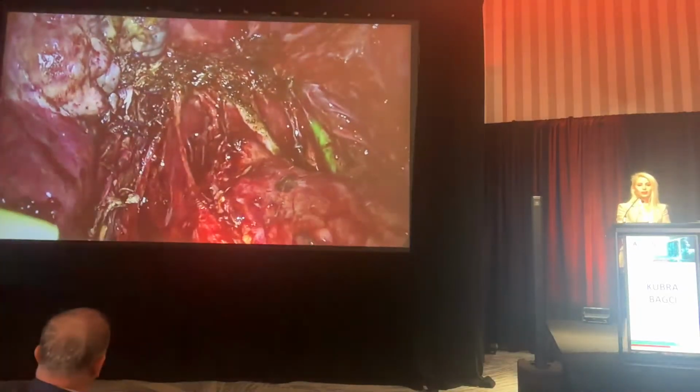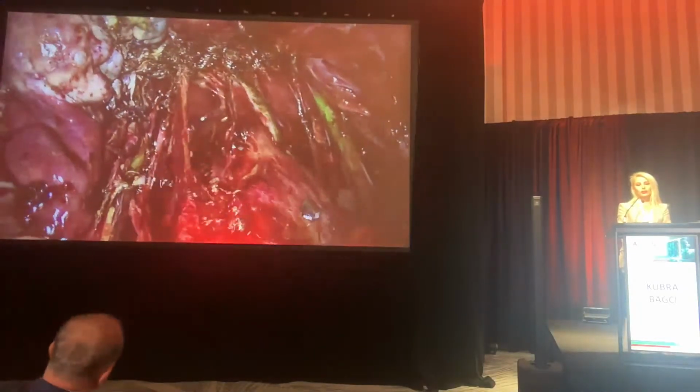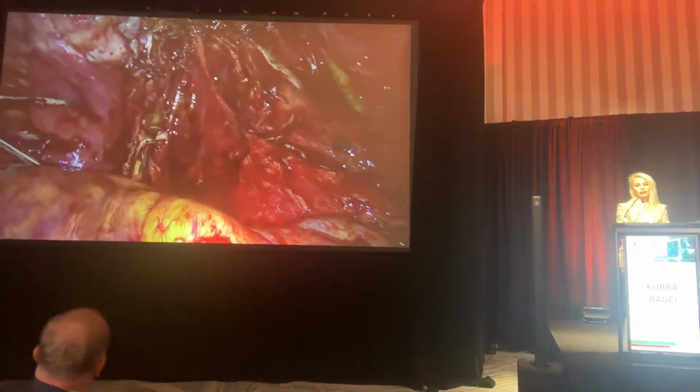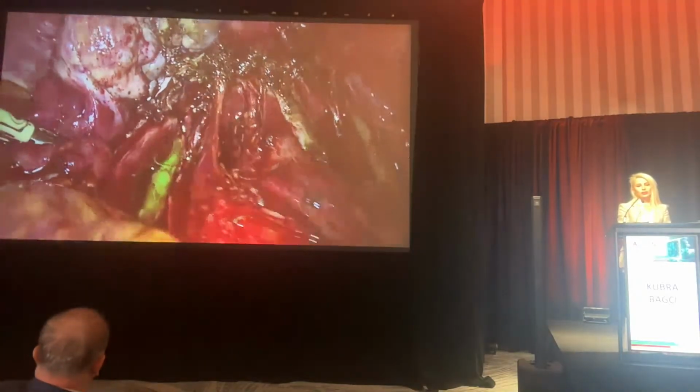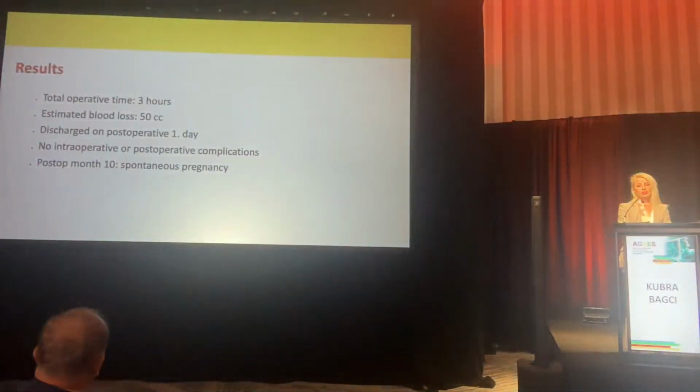The total operation time was 3 hours with an estimated blood loss of 50 milliliters. ICG fluorescence was still observed at the end of the procedure. The patient was discharged on the first postoperative day and achieved spontaneous pregnancy 10 months later.